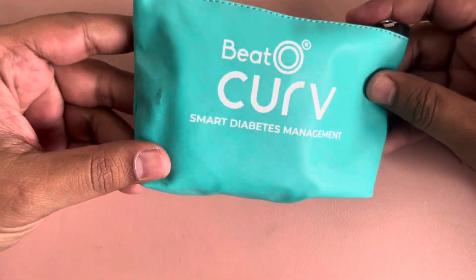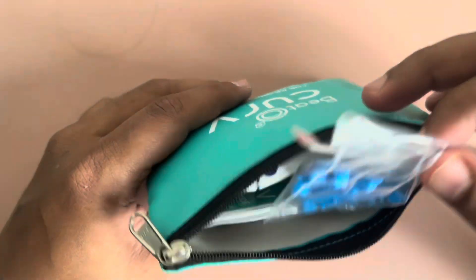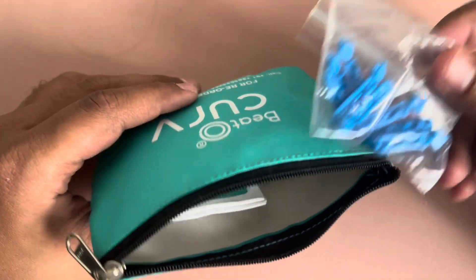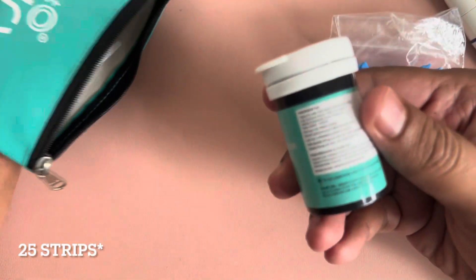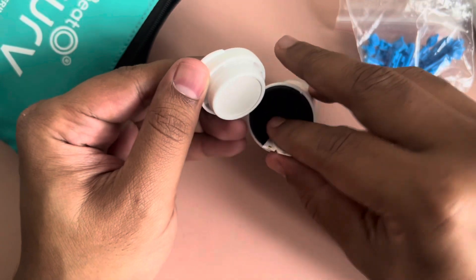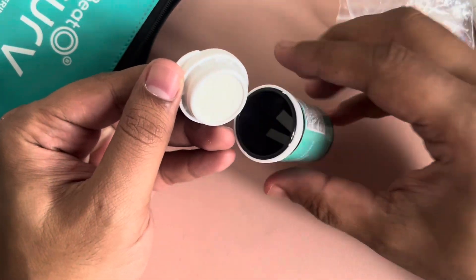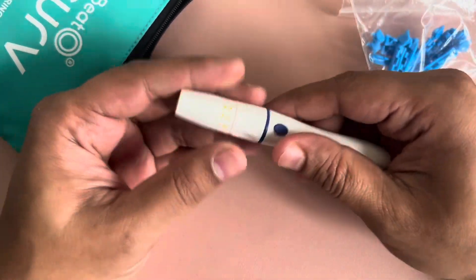So for this I have this Beto Curve. It's from the brand Beto. It costs around $5.99. They provide 50 lancets — these are called lancets — and they provide 50 strips. That's where you actually put in a little blood for testing. This is what it looks like. And they provide you a lancing pen, something like this.